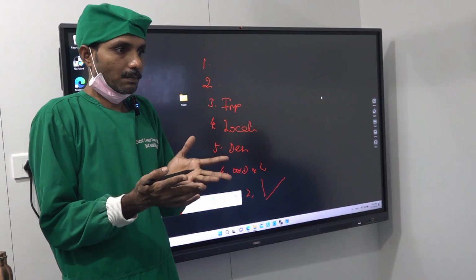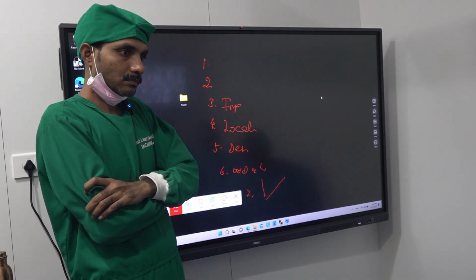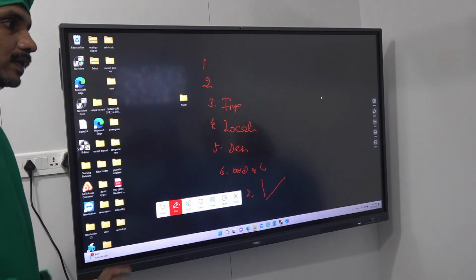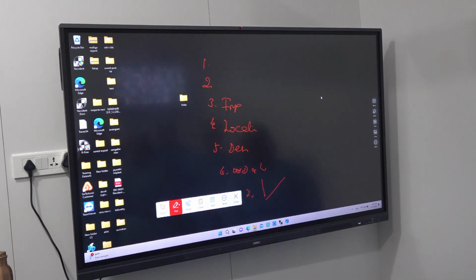You are not bending the implant. You are just placing a multi-unit. In conventional, what do they do with pterygoid implants? That will also be angulated; they will have a separate multi-unit that has angulation. It's a very osteoporotic bone, no? Very osteoporotic bone. Many patients come above 45 years, women, the bone density is coming down.